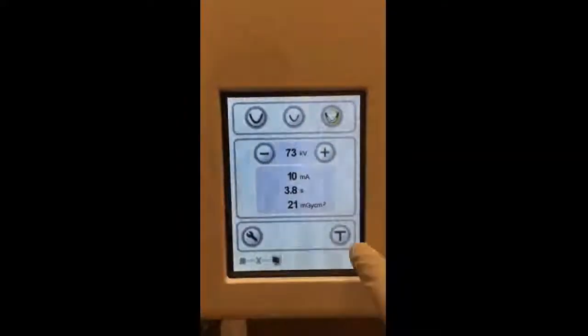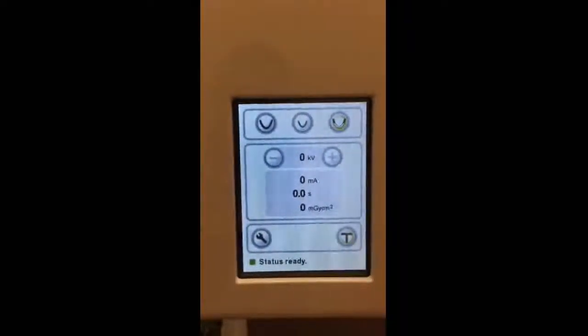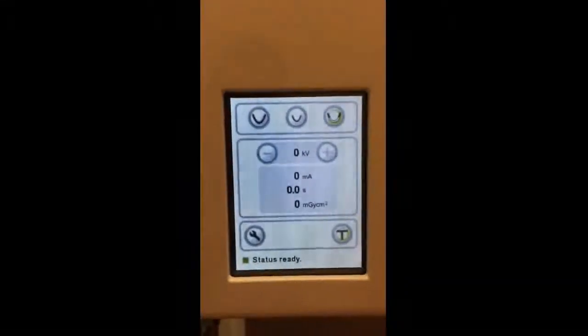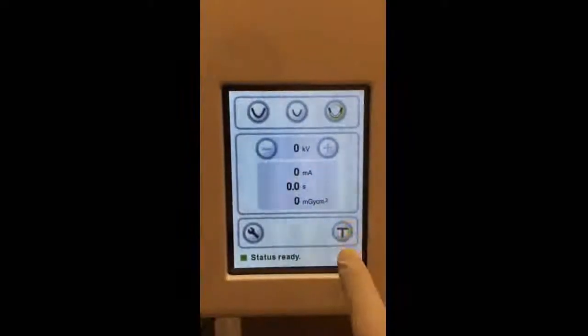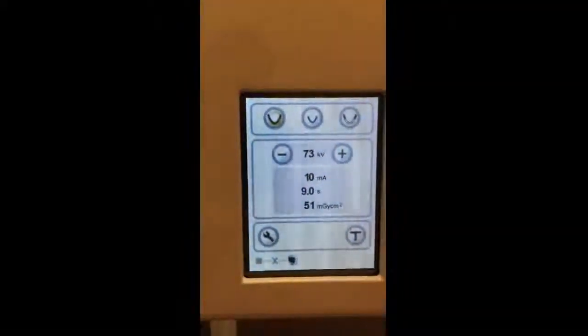on this unit. The T button here is nice. It eliminates all the radiation. You'll notice all the numbers go to 0. This is very handy for patients that have high anxiety with taking pans. It moves and sounds like it's taking a pan with no radiation. Once you've done that, simply touch T again. It turns your radiation back on. Make sure you have your program selected.